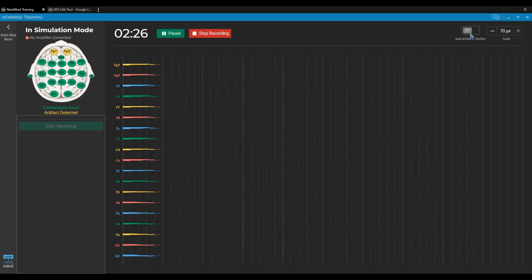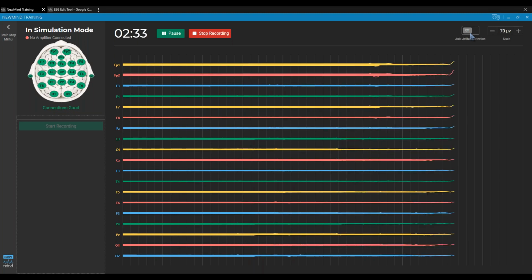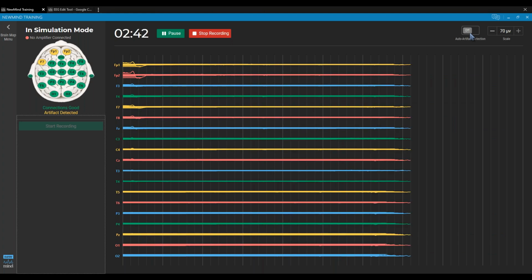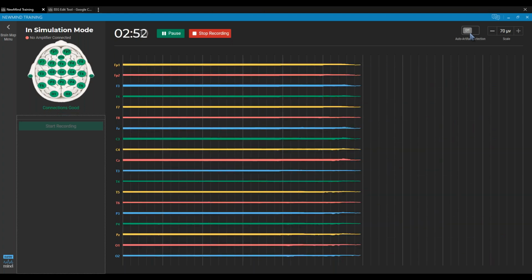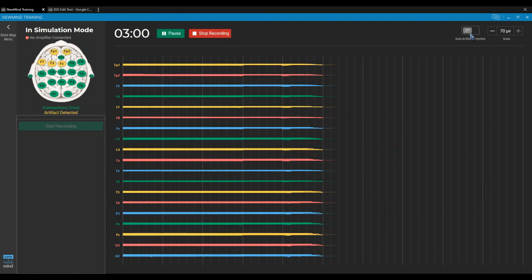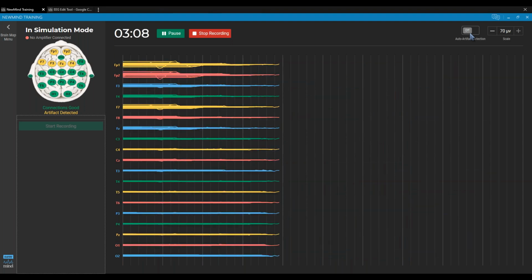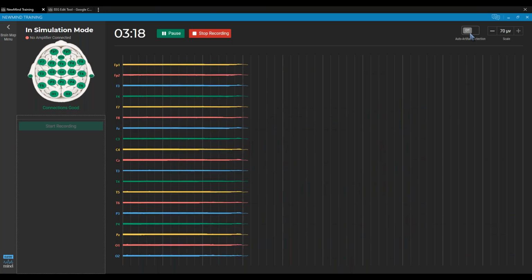Now, you need 30 seconds of clean data to actually create a map and a report. So if you record 5 minutes, you can generally pull 30 seconds out of that. This is the exact process I do when I record a map on my dad. Like I mentioned Wednesday, he had a stroke years ago.